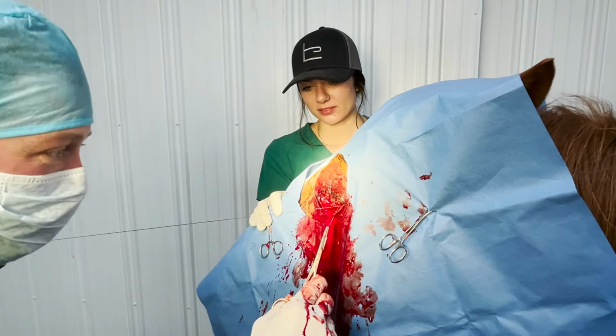So here's the eye we got out of there. There's the third eyelid in that corner. There's a big T-shaped cartilage. So when she blinks, that third eyelid acts kind of like a windshield wiper and gets stuff out of there. Sometimes we can remove just that if it's cancer or some other standing surgery like that.